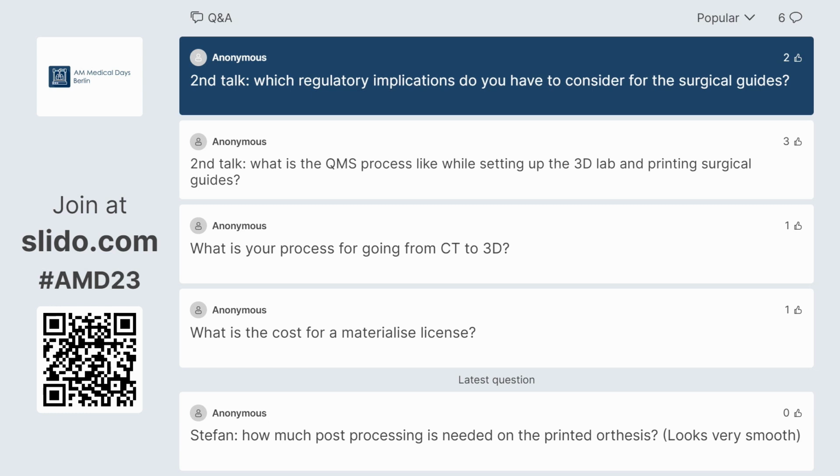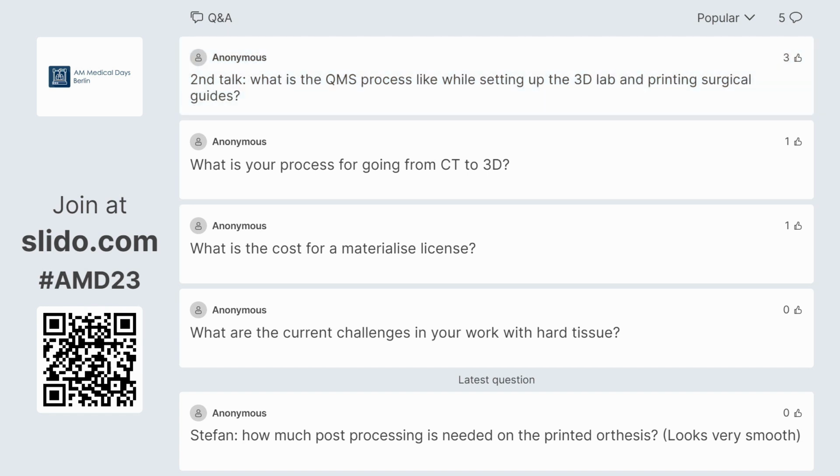But also, our surgical guides are the only ones that we design at the hospital, but we print them externally, so that we know that they do all of the testing and everything. So when we get them, then they're... That's a good point, definitely.